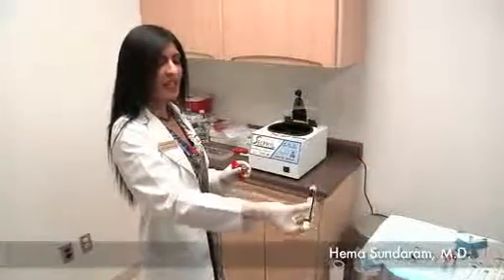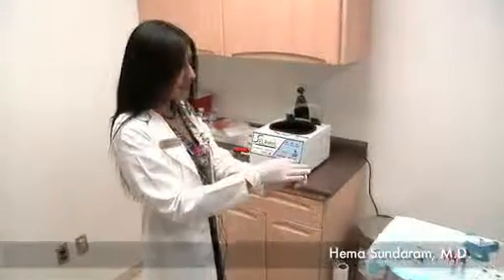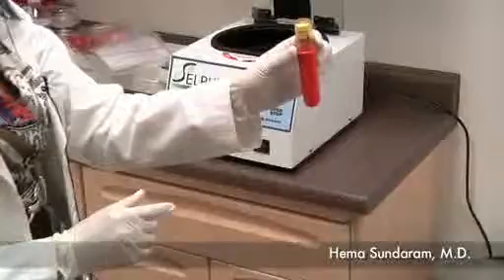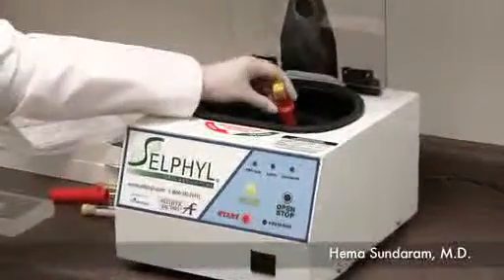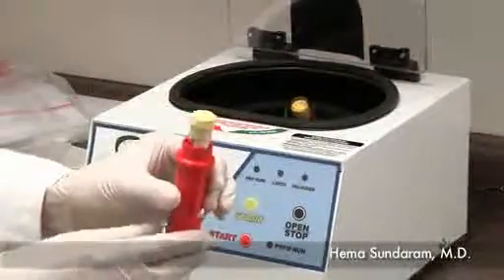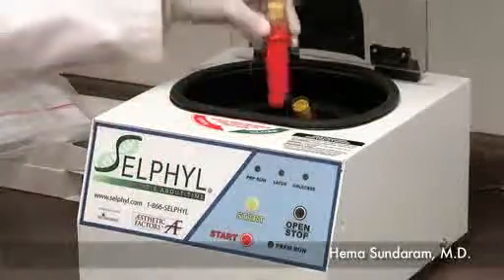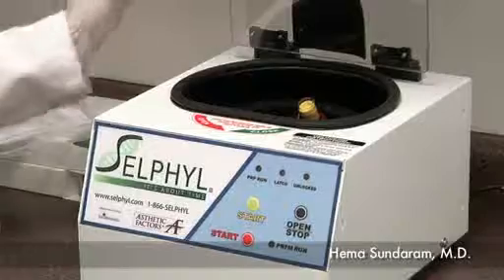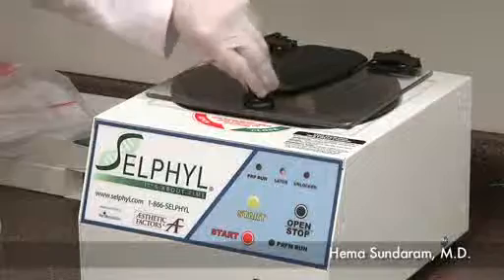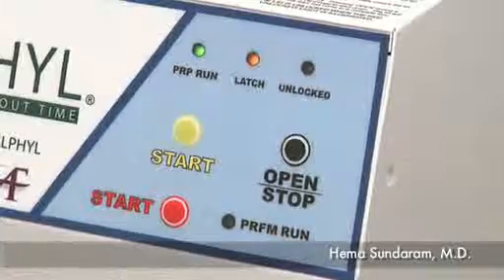The tube is inverted 10 times. It's then placed into a centrifuge holder and placed in the centrifuge. We can use a counterbalance tube on the other side. The tube will spin now for 6 minutes.